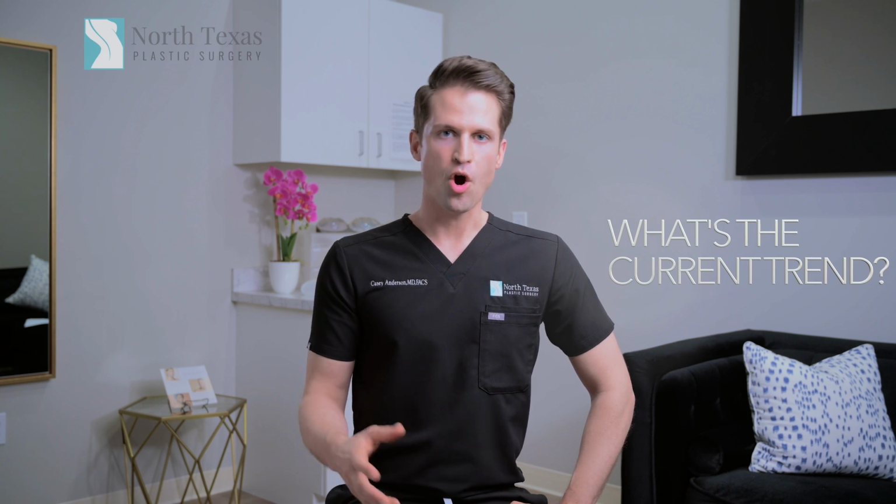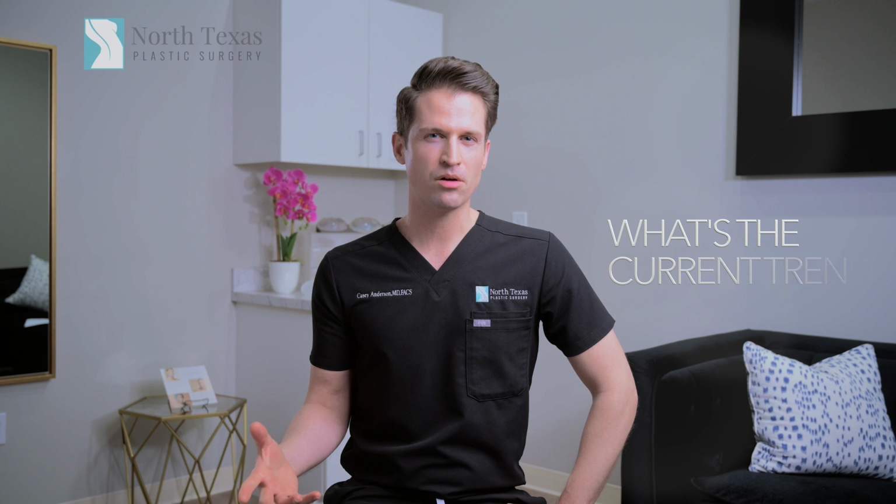The things that I always tell people when we're talking about saline versus silicone, first, people kind of like to know what the trend is. Overwhelmingly, people who come to me prefer a silicone implant, and one of the biggest reasons is that it has a tendency, after things settle, to feel more natural than a saline implant. A silicone implant is a little bit softer, and it will settle into that teardrop shape that can look a little more natural as well. Saline implants have a tendency to look and feel a little more firm or a little more fake compared to silicone. And again, that's a preferential thing, and we'll go over all that.